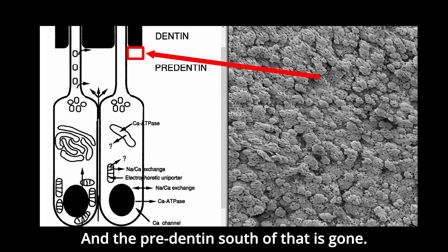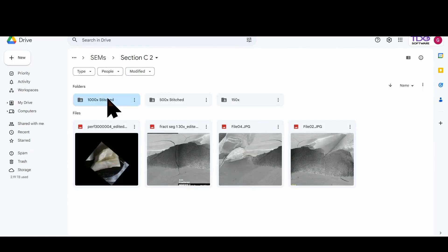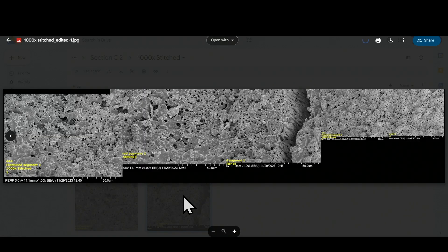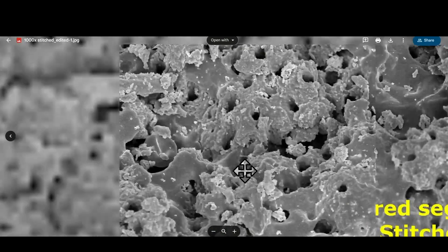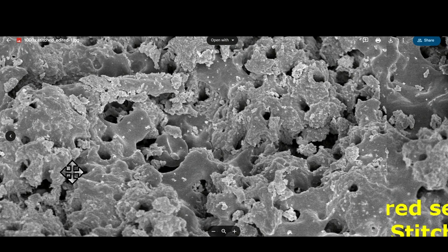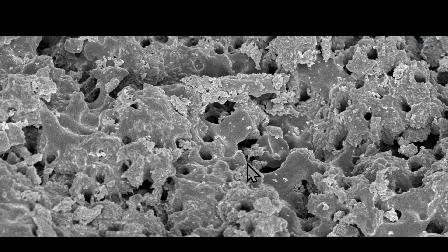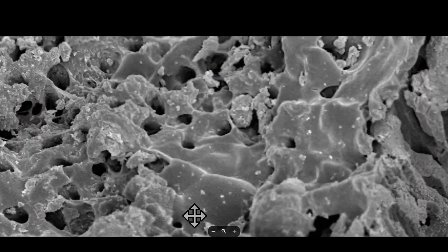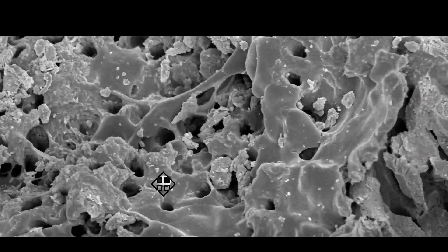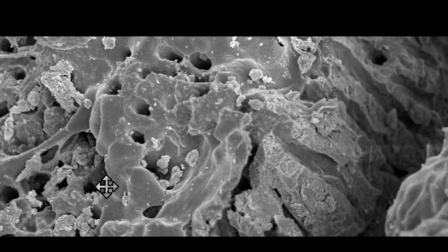So now, when we go in and we looked at the higher powers, maybe this will make more sense to you. There you can see the pre-dentin. It doesn't look like a lot of decalcification has been done. This is just what dentin looks like after the use of sodium hypochlorite.